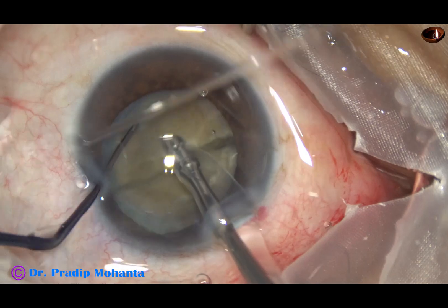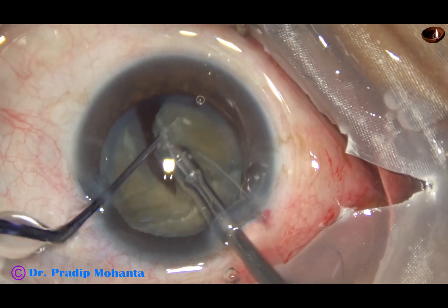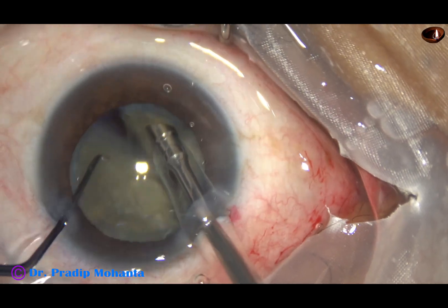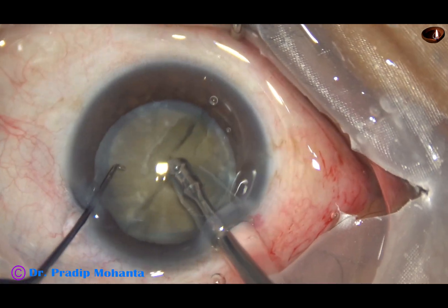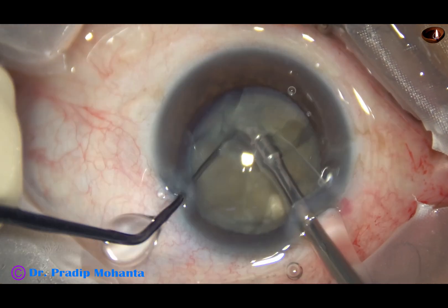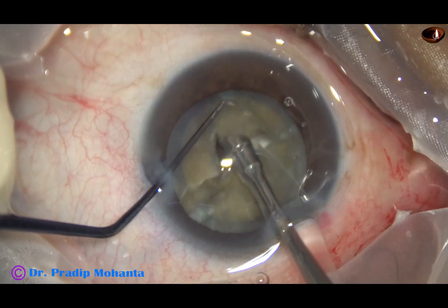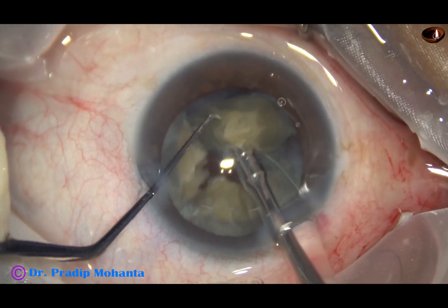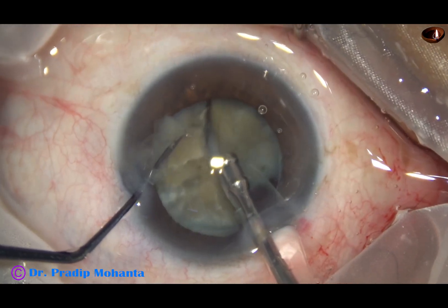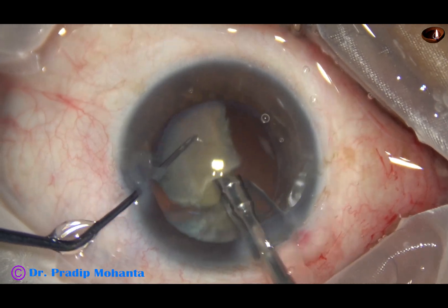Hold it 90 degrees away and get another crack. This nucleus is brittle and I am getting the facets very easily. Now I come to the other hemi-nucleus and chop it into two fragments. Each fragment is emulsified with ultrasonic energy set at 70% in this case. Flow rate is 45 ml per minute, and vacuum is 450 mm of mercury.